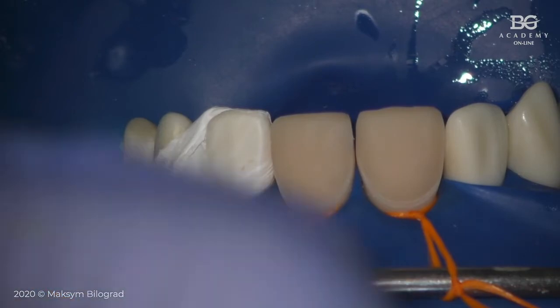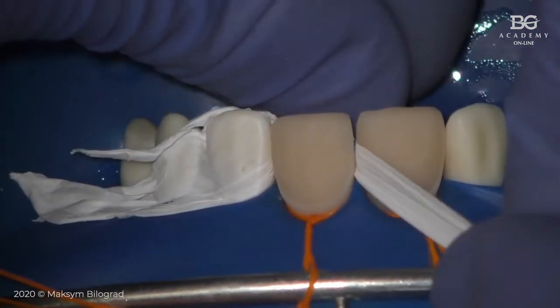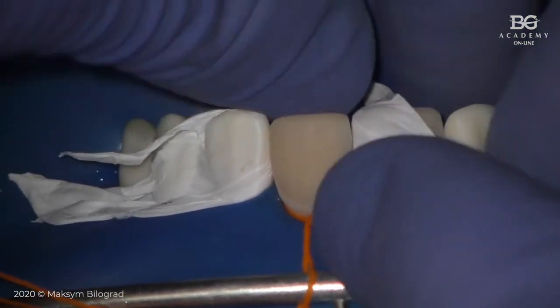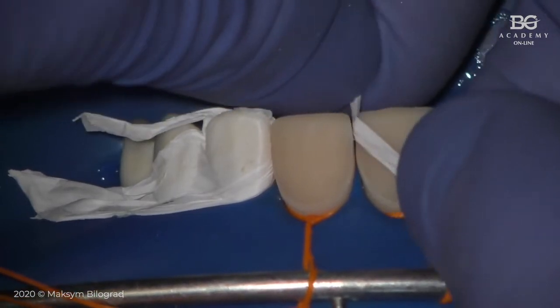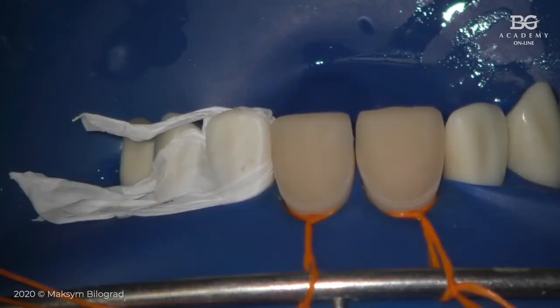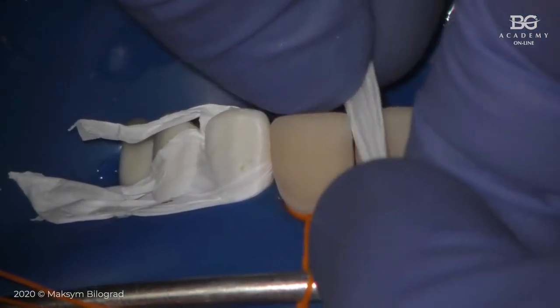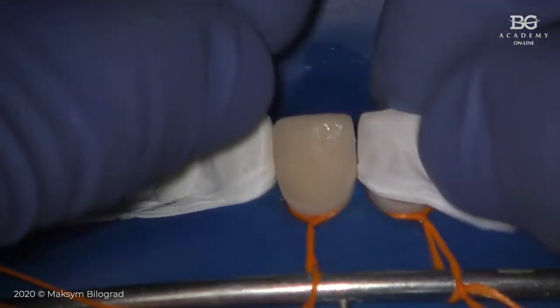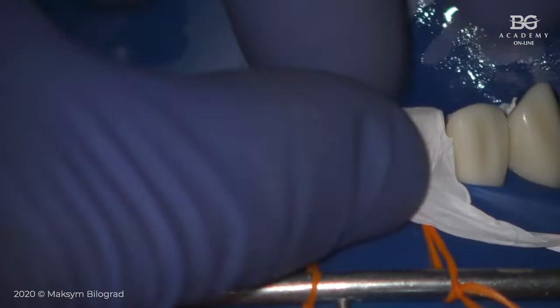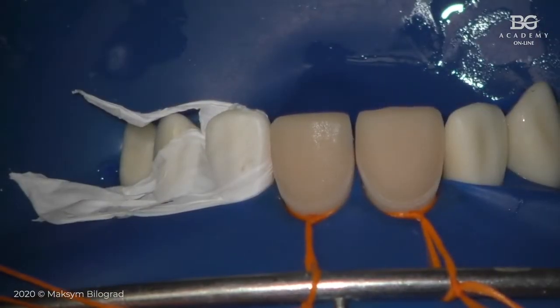I will take another one. What happens with my hands? I think that not Teflon bad, my hands are bad. In this evening. Okay, yeah, basically it has to be really fast, not like I showed you, and not perforate. Oh my God. Okay, let me do another thing.